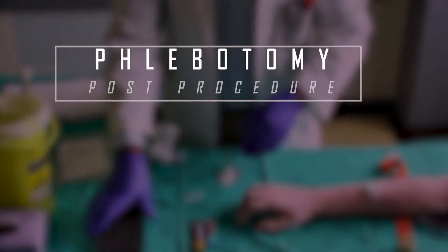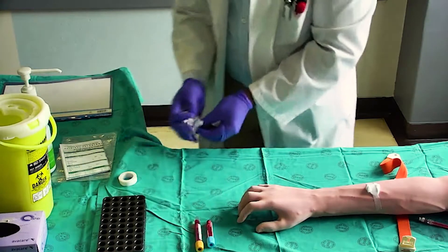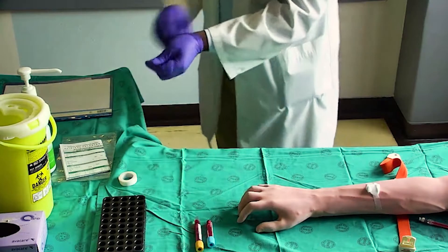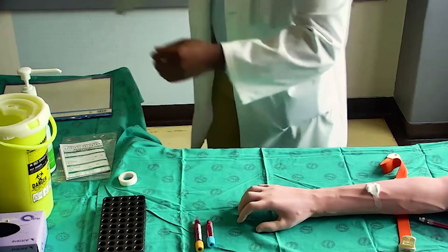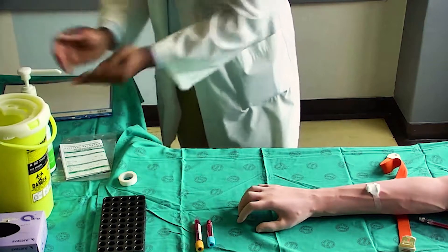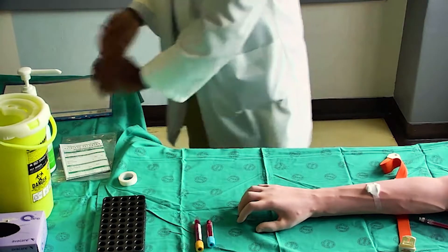Thank the patient and ensure that the patient is comfortable. Discard all used medical waste into the red bin and discard all used general waste into the clear transparent bin. Remove your gloves. Wash your hands with soap and water or disinfect your hands with disinfectant.